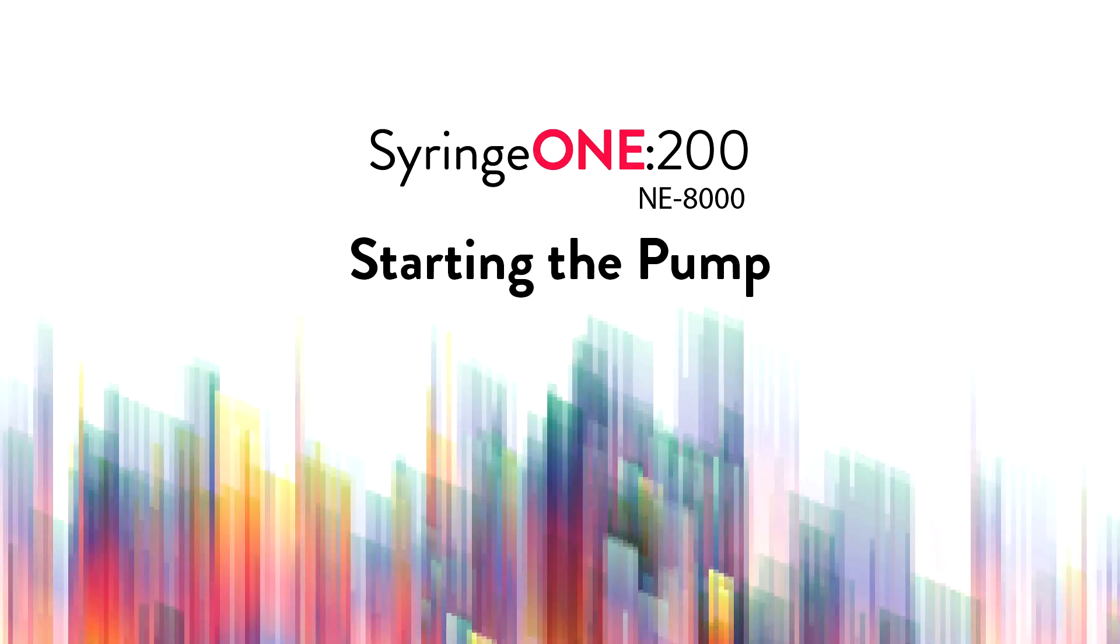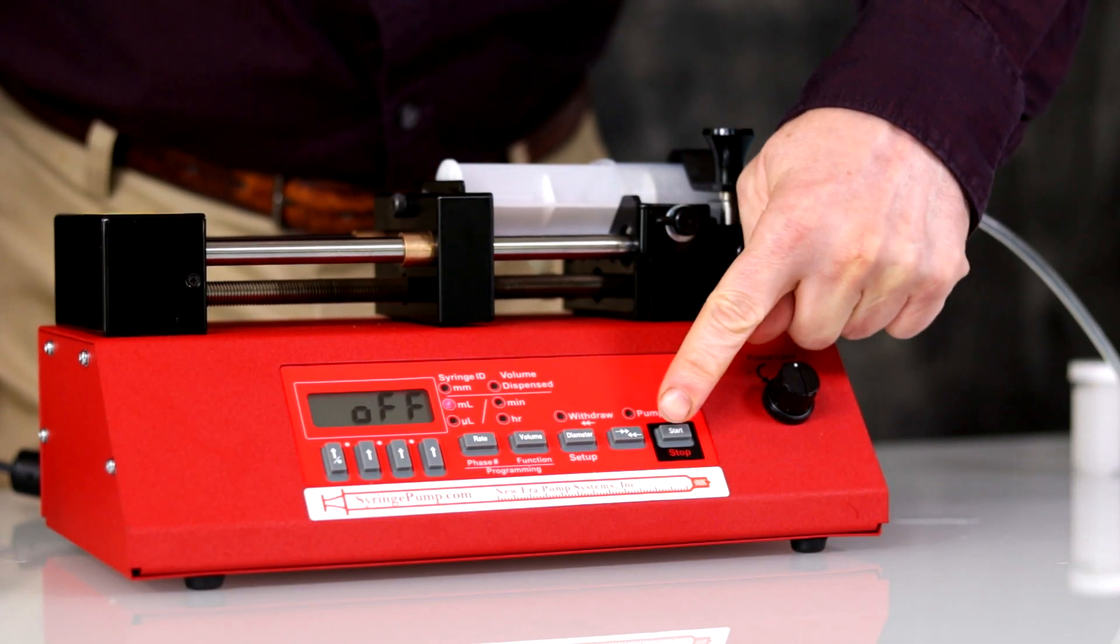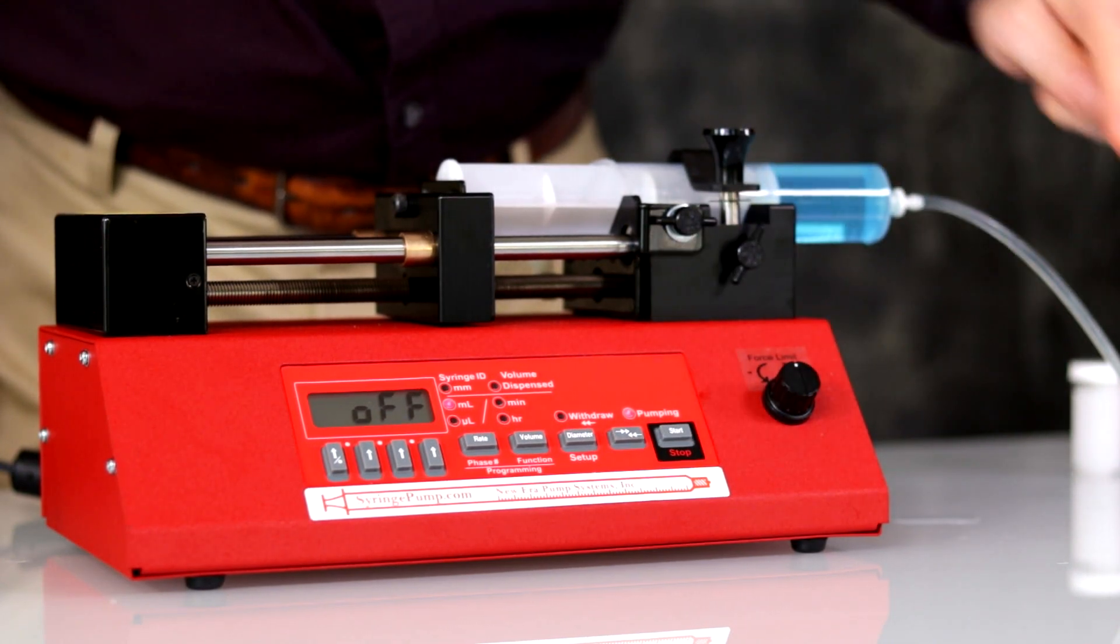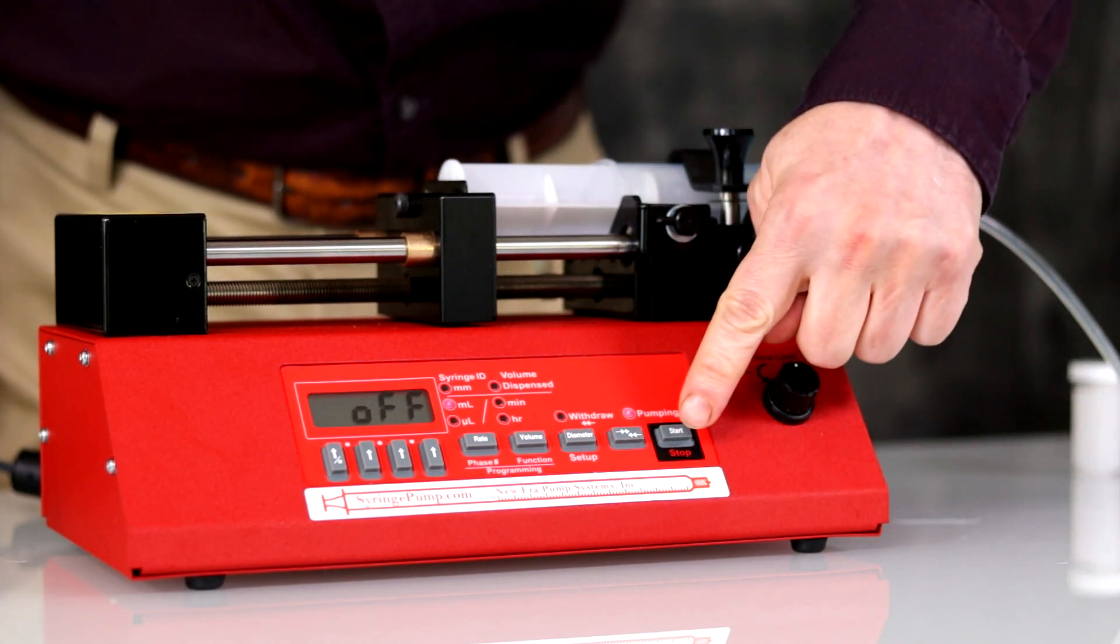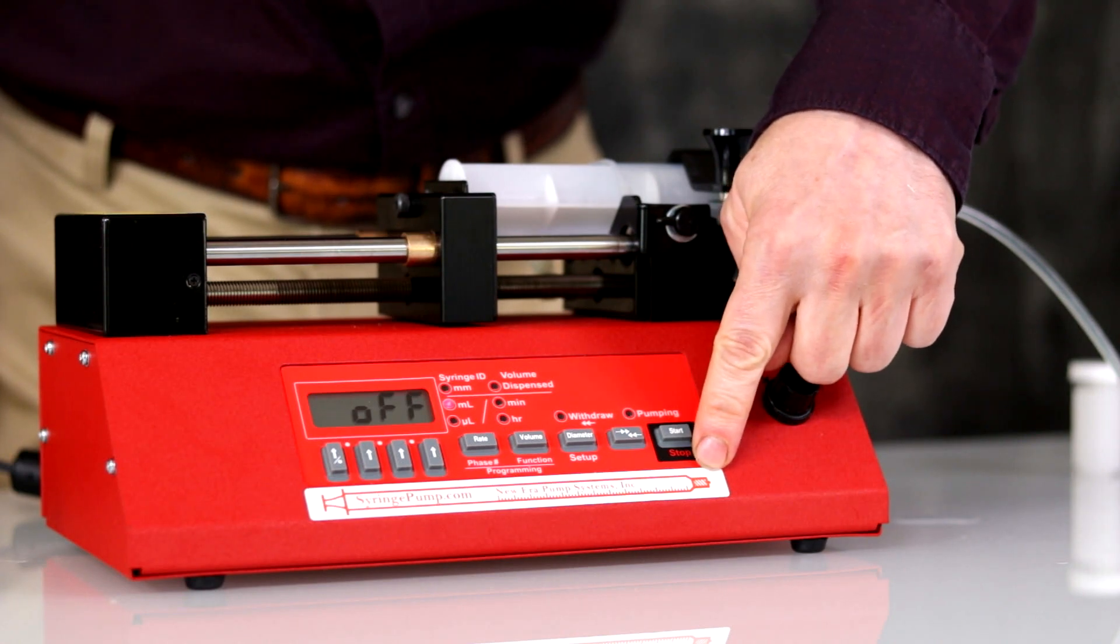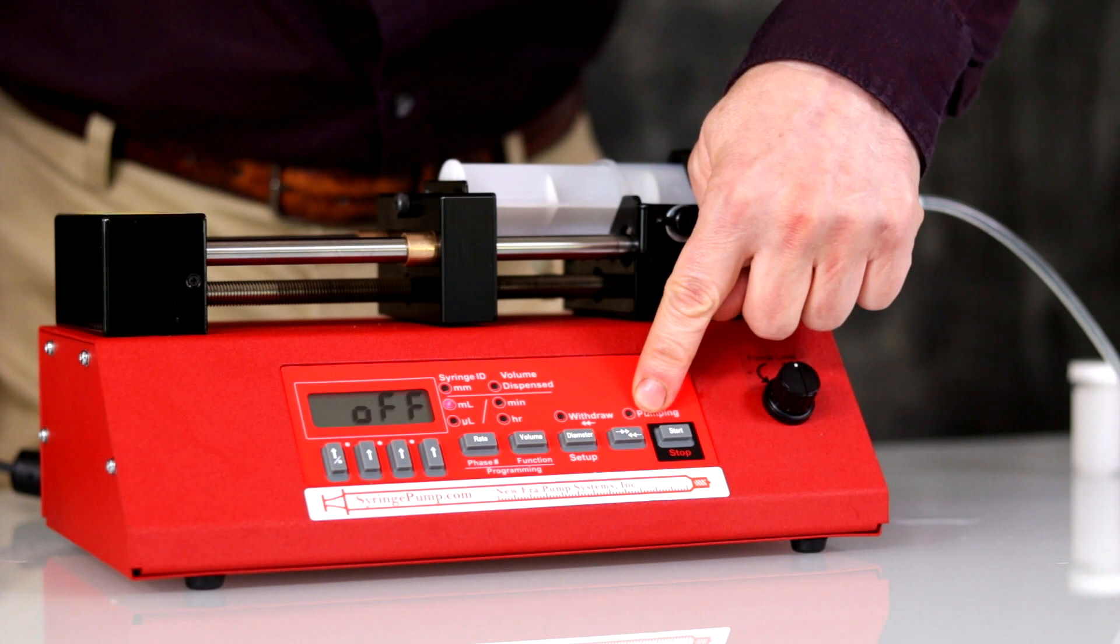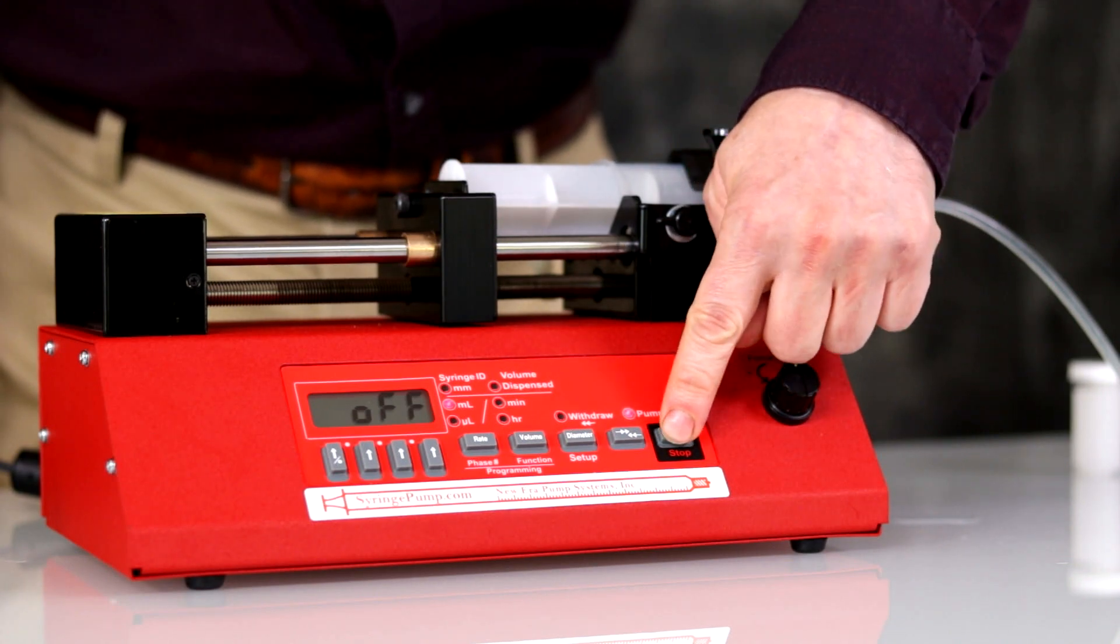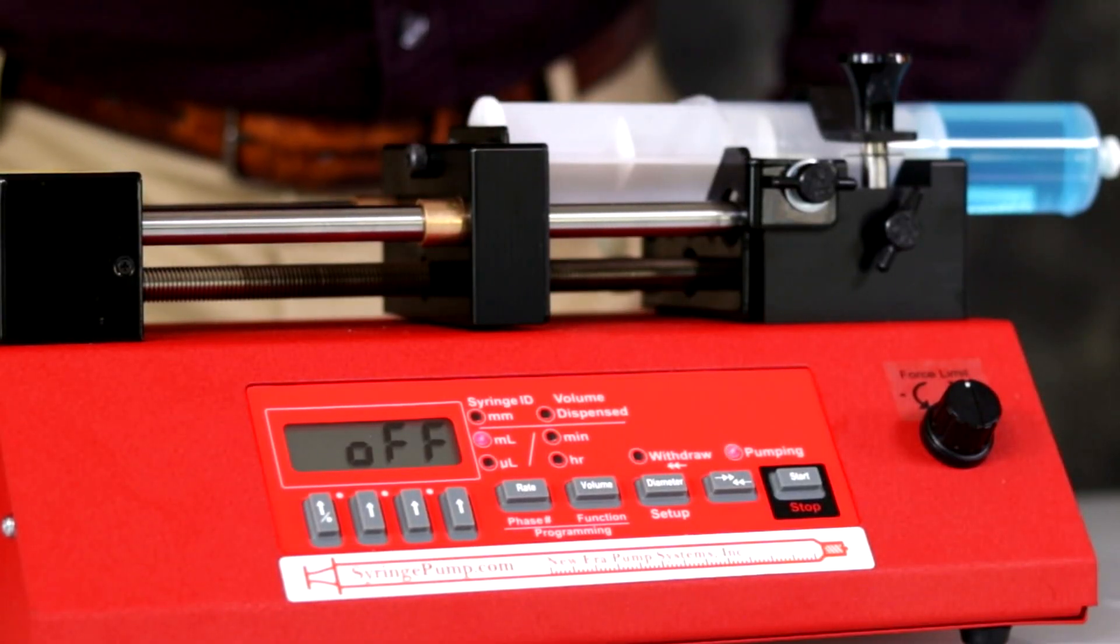NE-8000 starting the pump. Ready for operation. To start your pumping program, simply press and release the start key. Now the pump is pumping. The pump will continue to pump continuously until you stop the pump. To stop the pump, press start again. Blinking indicates the program is paused and will continue where it left off when you press start again. If the pump hits the limit switch, it will stop automatically.